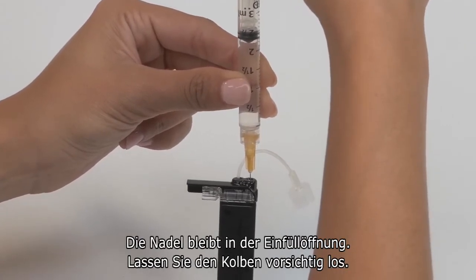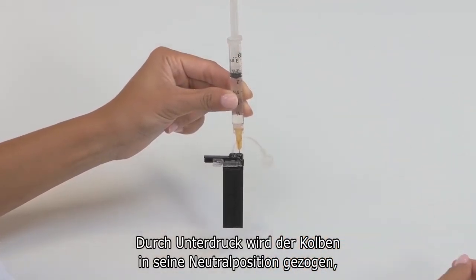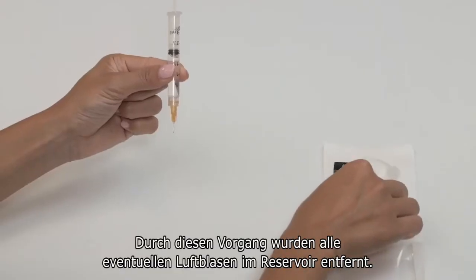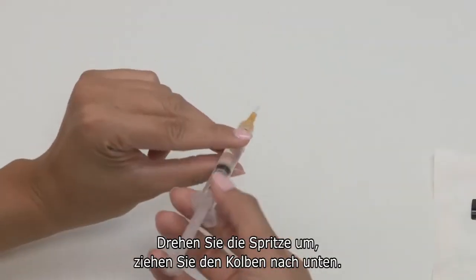With the needle still in the cartridge, gently release the plunger. Air pressure will pull it back to a neutral position but will not push any air back into the cartridge. Now you can remove the needle from the fill port. This step removes any air that may have been trapped in the cartridge bag.